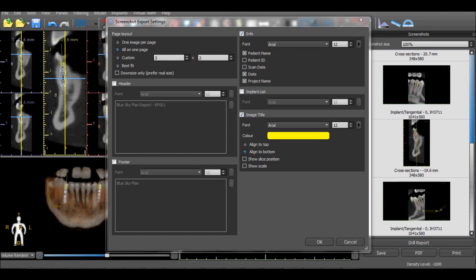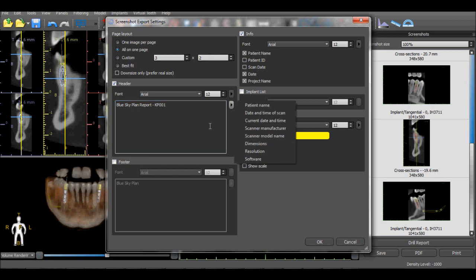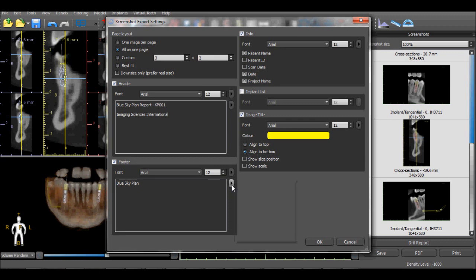The dialog box allows the user to define how the report will be generated. In the Page Layout section, the user can select how the images should be laid out on the page. The Header selection allows the user to include a header with any text they would like. The user can enter their own text into the boxes or select from different options of information to be included in the report. The font, size, and style can all be selected as well. Similar options exist for the footer.